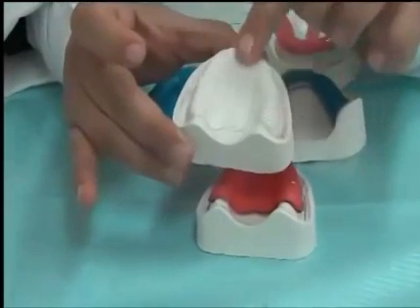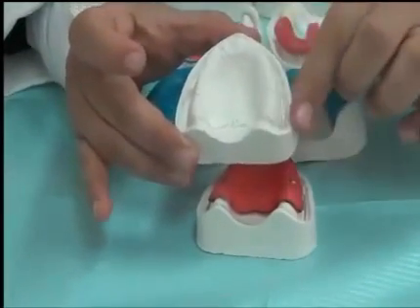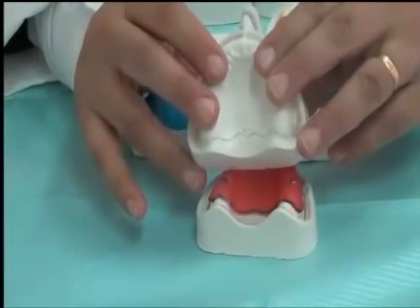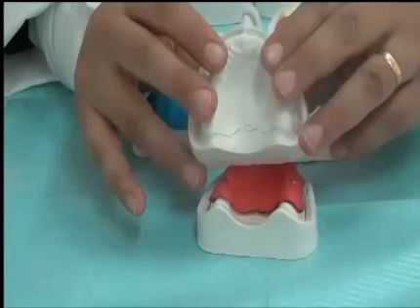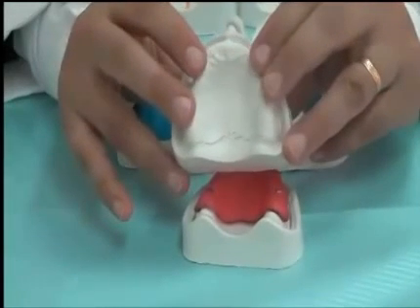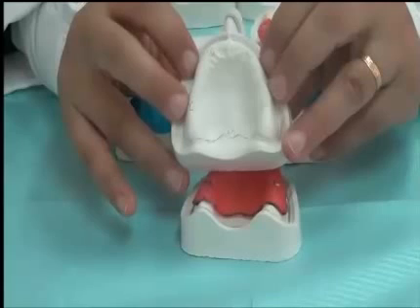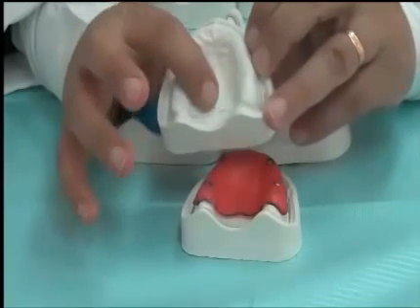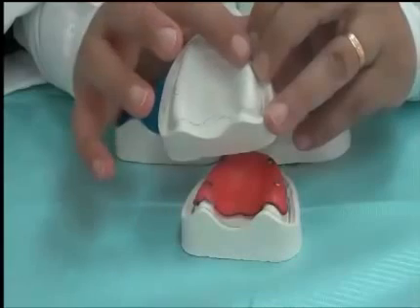It will not stay in its place while in function. It will be going in and out by the compressibility of the tissue. With this extra compressibility, the denture will sink more into the tissue and once more exert pressure on areas that we should have been relieving.